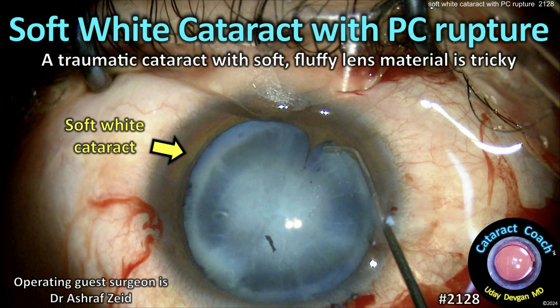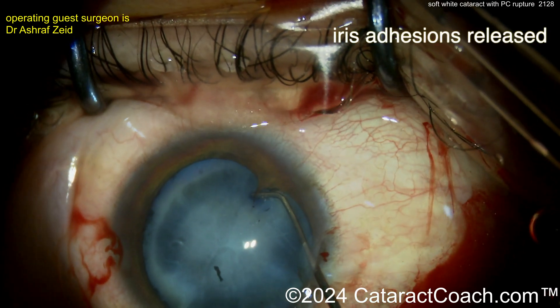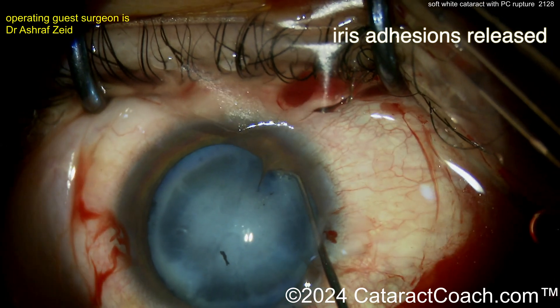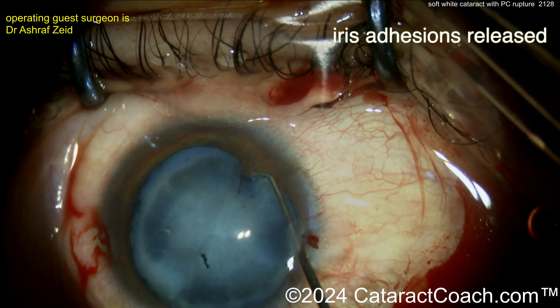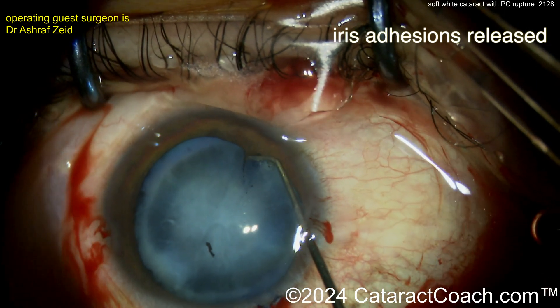From cataractcoach.com: a soft white cataract with posterior capsule rupture. A traumatic cataract with soft, fluffy lens material is tricky. You can see there are some iris adhesions to the lens capsule — those can be gently separated. The capsule has been stained with trypan blue dye, and you can see this is an unusual-looking cataract with a lot of opacity.